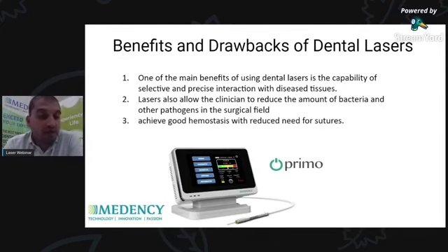The good thing also, which I was facing in the conventional methods, is that we used to have a bleeding site in many cases, and I used to refuse many cases due to this. But when we use laser and compare it to the conventional method, you will see the hemostatic effect and its benefit on your work. You can be working with a clear site, which gives you a much better treatment option for this site.